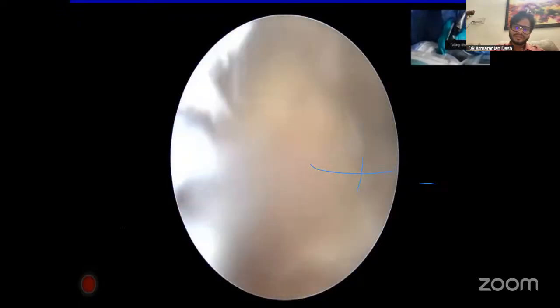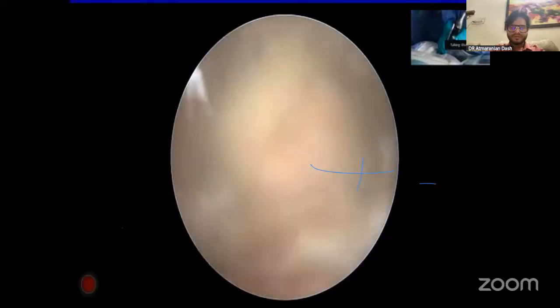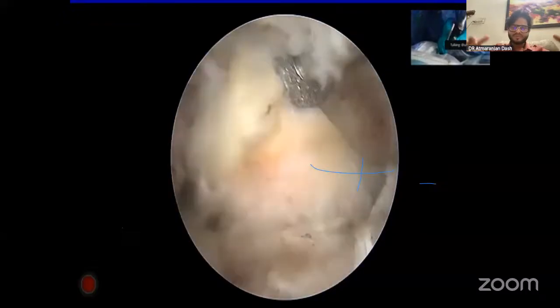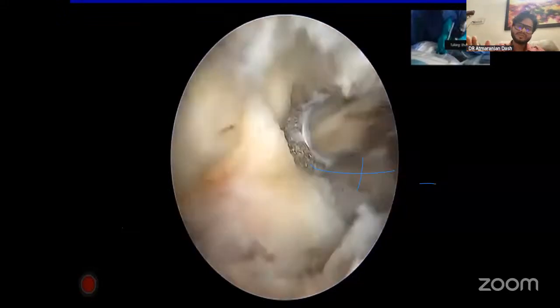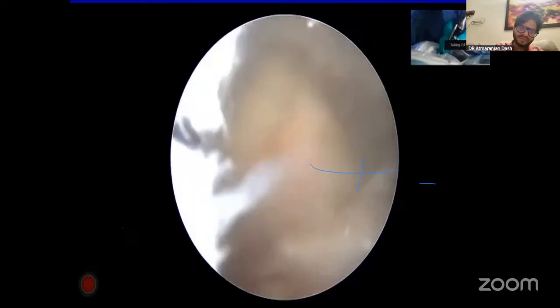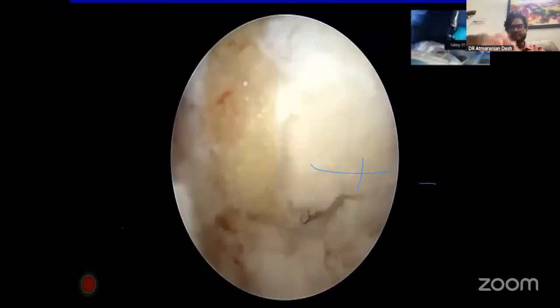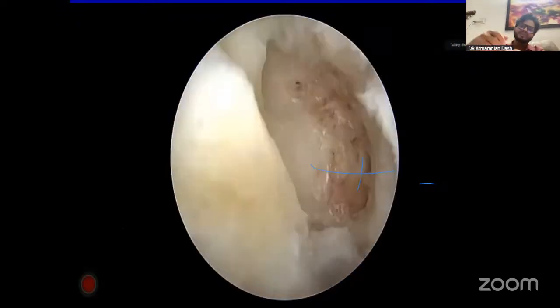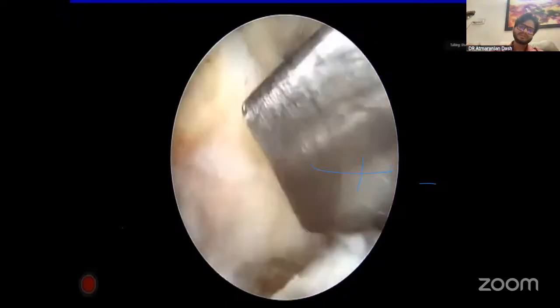You can see we are continuing the drilling process. In biportal, because both hands are engaged, the surgical duration is very fast. You won't see any muscle during the surgical process. Whenever we do other ways of endoscopy, we put in instruments and remove muscles, which is not needed in these cases. We directly go to the subperiosteal plane and start working there.